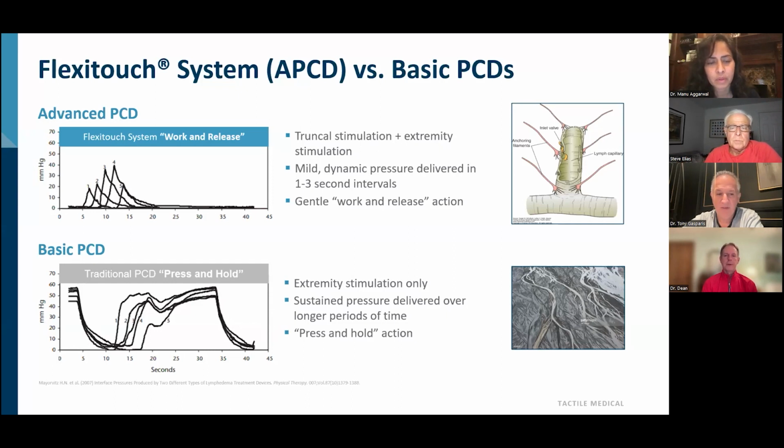Great points. And really, here is just showing you again how with the hold and squeeze and push, it basically pushes the fluid up, versus with Flexi Touch, you're pulling on these anchoring filaments on the lymphatics, opening up the lymphatics to be able to reabsorb, to pick up the interstitial fluid and push the fluid along the lymphatic channels.